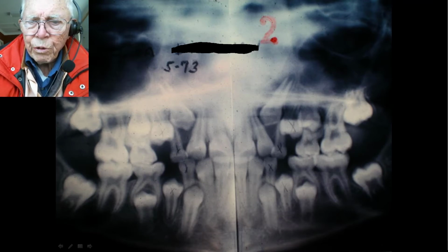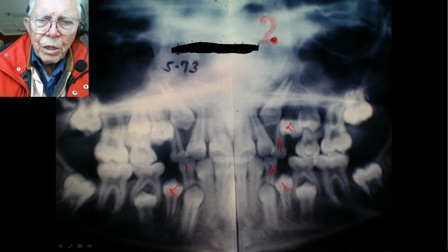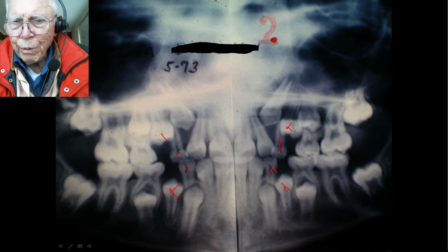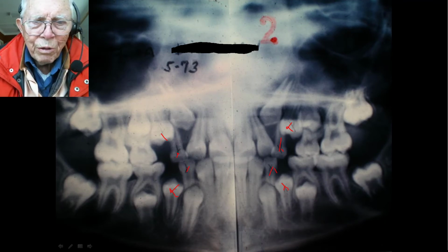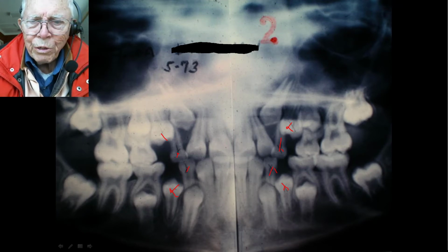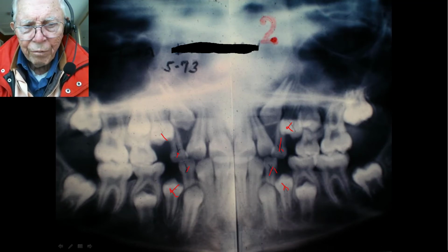All right, now we're going to come in and eliminate these teeth here, plus the permanent teeth in here, plus all these teeth we're going to take out. Now you think that's terrible, we're going to do that. But she's got wisdom teeth developing, and well, we can't see them at this age. She's quite young, but we feel that she will have them.